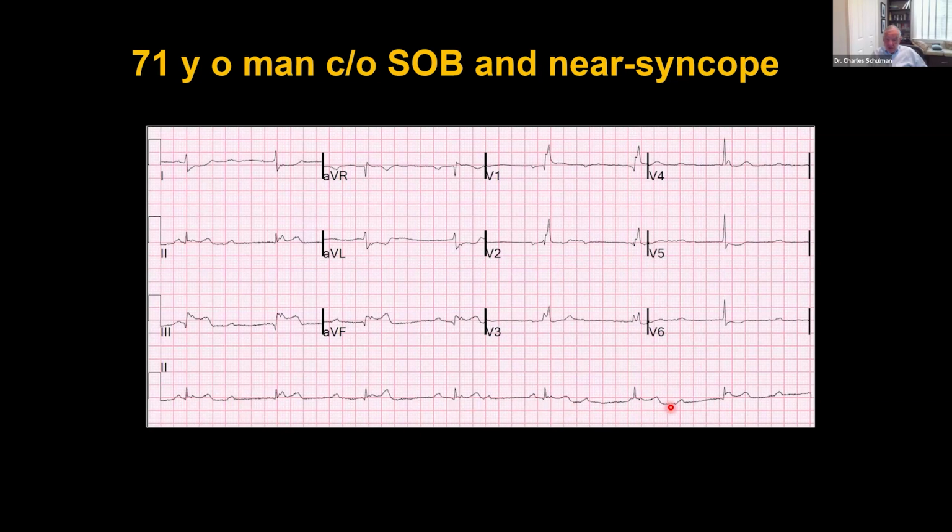We've talked about third degree AV block in the first talk, and it is due to a clot or obstruction of the right coronary artery, because there is ST segment elevation in leads 2, 3, and AVF. And because the ST segment elevation is higher in lead 3 than it is in lead 2, that is 90+% the right coronary artery. Now, why?